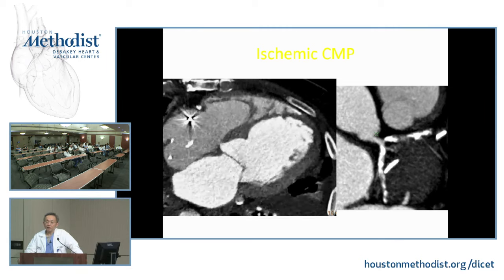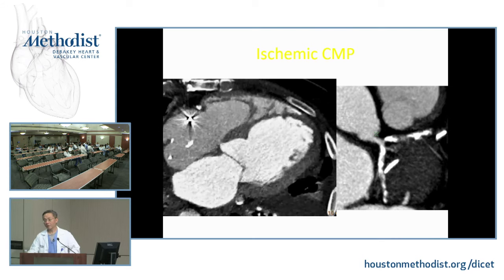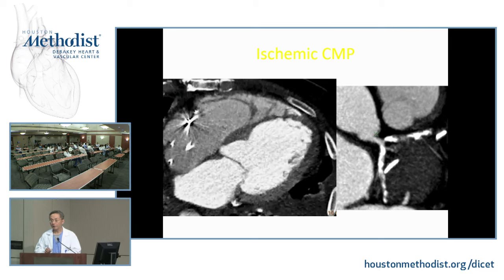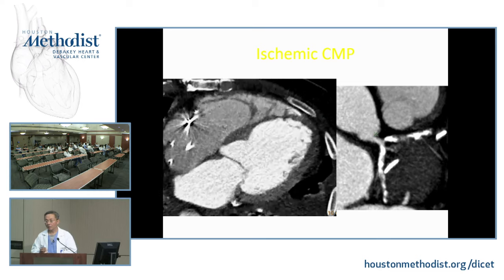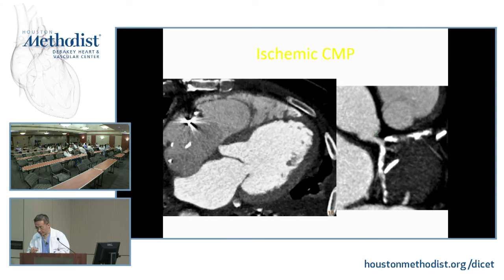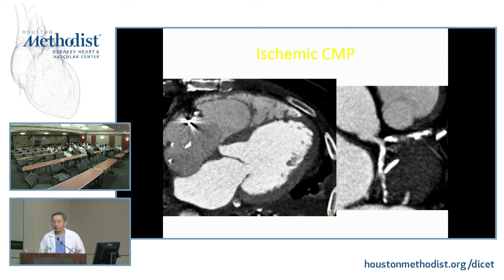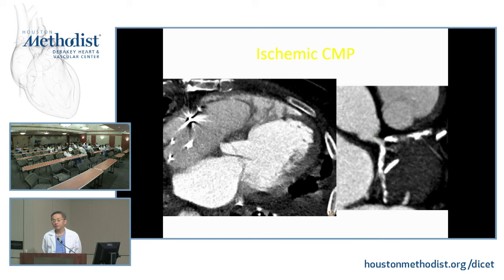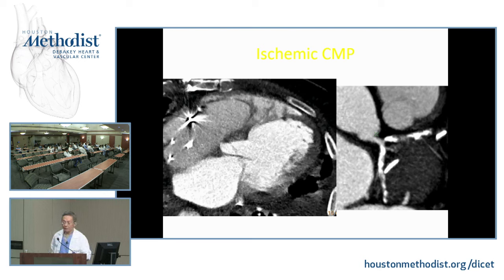But in our lab, we don't turn down coronary CTA. My view, at least what I do in my practice, is that I still do calcium score before CT. Yes, I agree that there are calcium scores done with DLPs of 150. But if you have a Flash right now, you can easily do it with a DLP between 30 to 60. The Flash calcium score helps me determine my Z-axis, so I eventually save on the contrast. And I published on that it does add, in symptomatic patients, which is most of the population, incremental prognostic value.